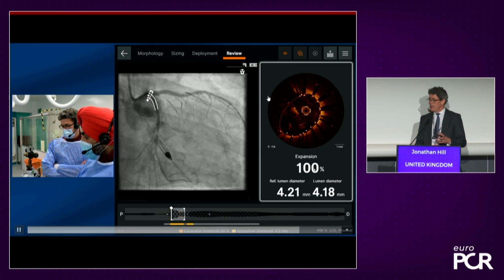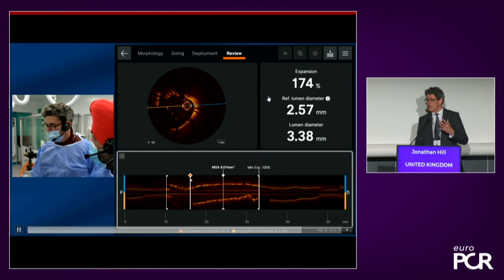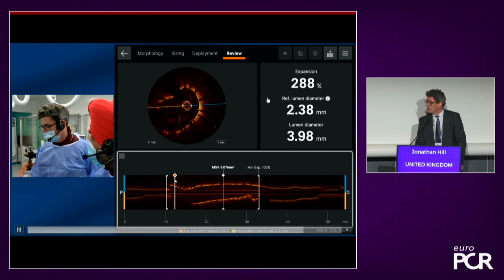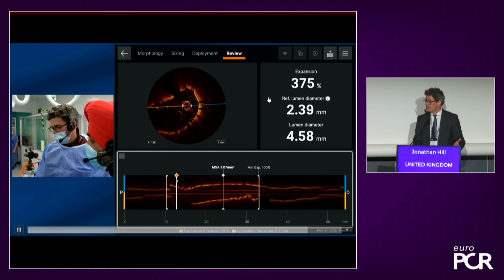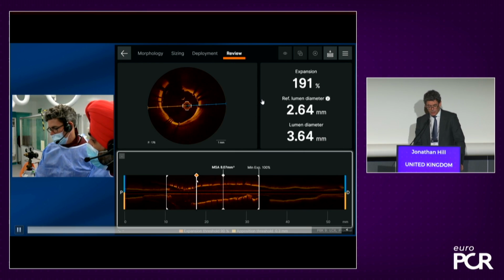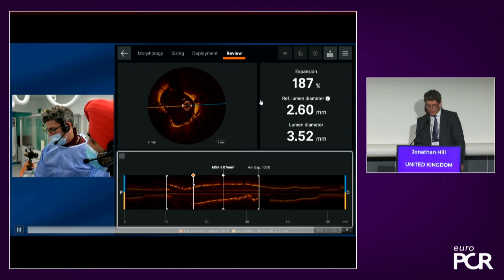And remember, the appearance of this was a really rather nasty, unpleasant-looking, craggy nodule, which previously we would not have thought you could modify with IVL. But there's been clear modification here using IVL. We've had 2 wires down at all times, and it's been done with protection with LV support and protection because of 2 wires being kept down at all times. At no point was there any slow flow.